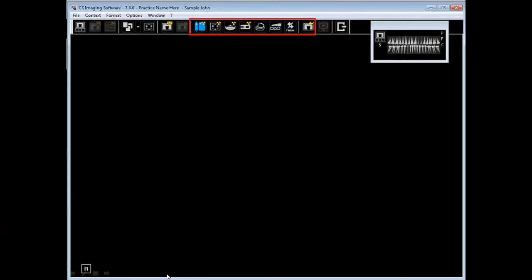On the main toolbar, these icons allow acquiring from various imaging devices. We will explore acquiring from RVG sensors in the Actions portion coming up next. There is a recorded class on acquiring scanned images in the CareStream Dental Institute.